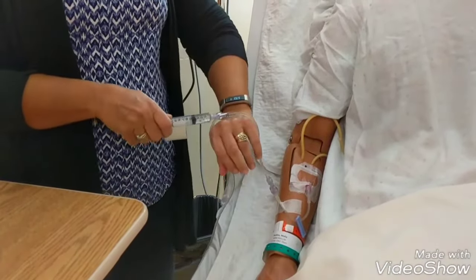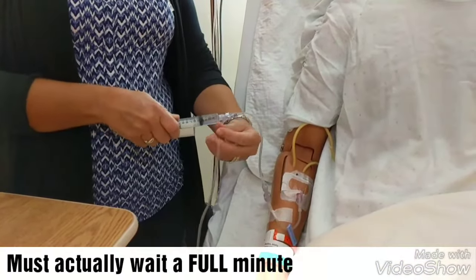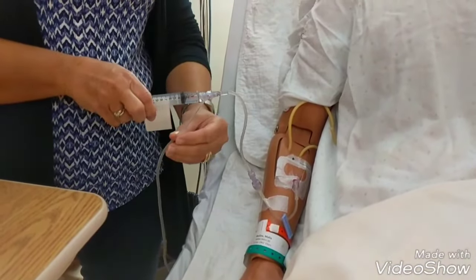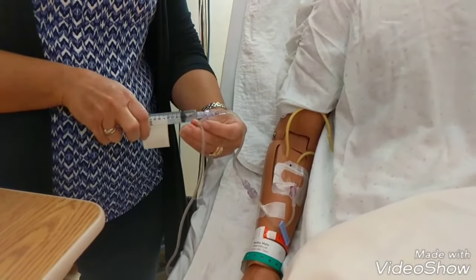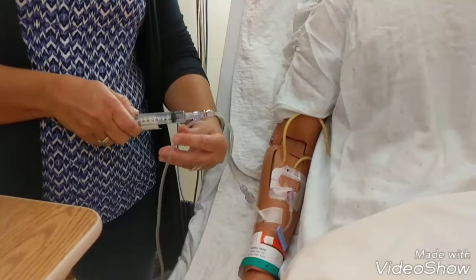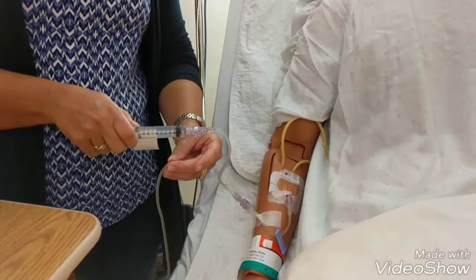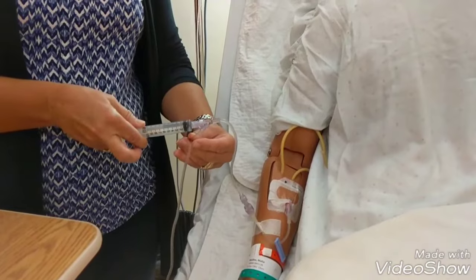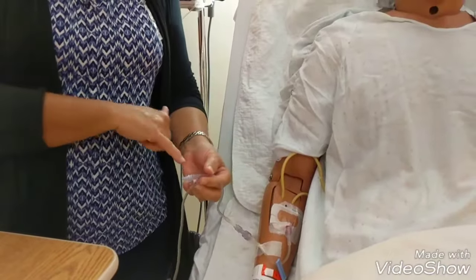I'm going to wait one minute as it goes through. Then I'll clamp the tubing again, put in the next 0.1ml, keep it open for a minute. A minute later I'll clamp the tubing again, put in the next 0.1ml, unkink my tubing, and let it infuse. Then my final 0.1ml — and I'll wait my minute.